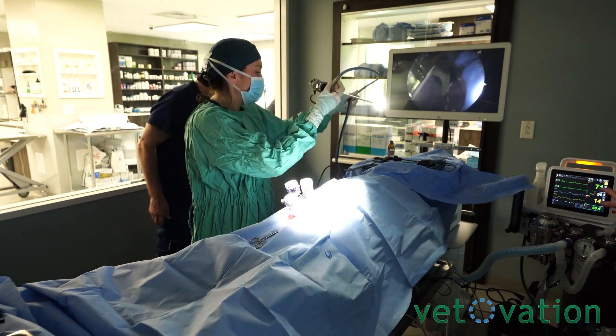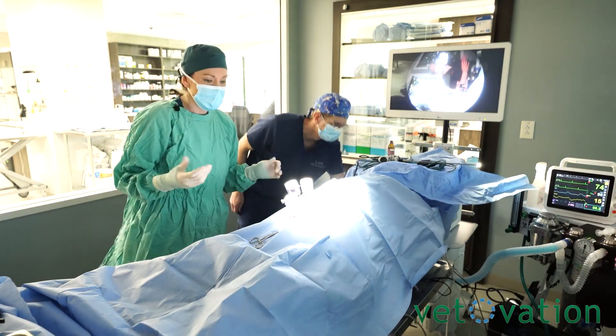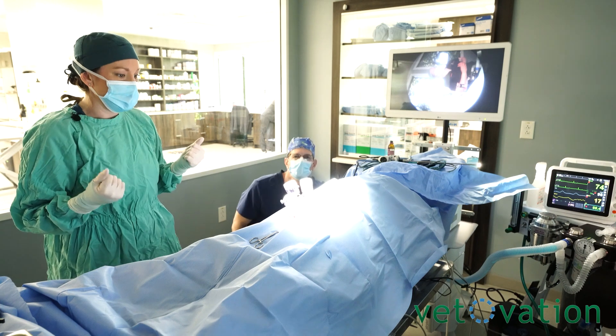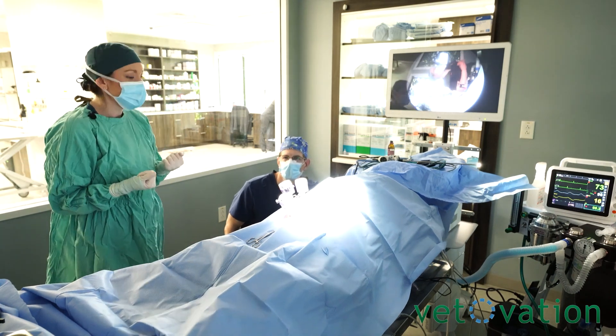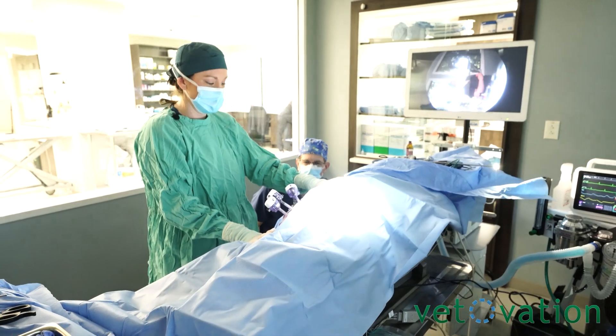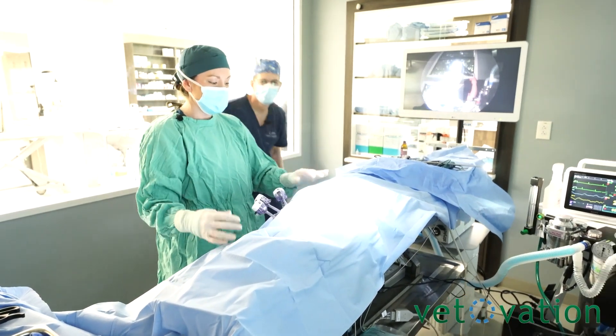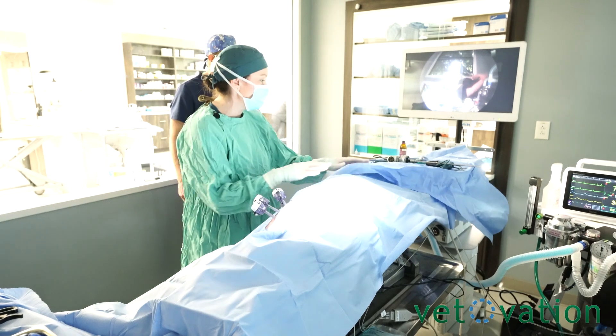Now we are going to flip her towards me. There's a button on the top of your tilt table. You want to put a hand on her. We like to hold them and make sure that our bungees are holding and secure.